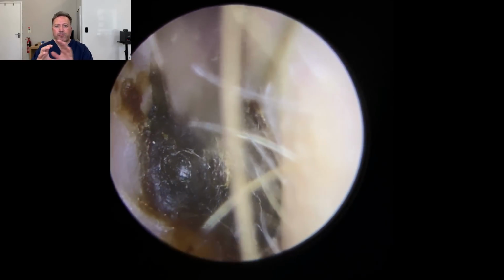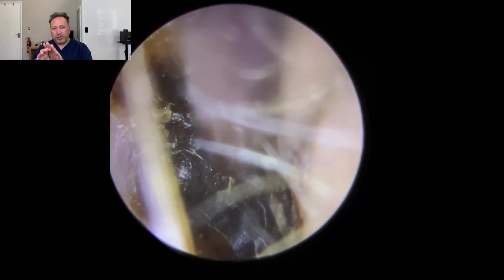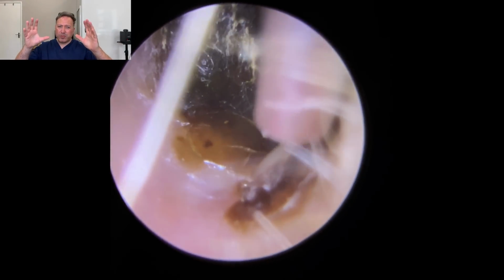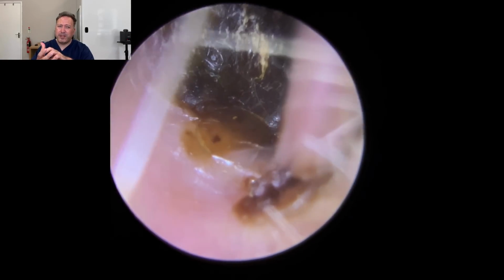Now what you can see has happened here is the wax at some point was probably quite soft. And then when they've pushed the Q-tip into the center of it, so if you imagine this is your wax, the Q-tip goes in and the wax does that around the Q-tip. So it spread it and stuck it to all the canal walls and caused this deep depression in the center, which is very, very deep in the ear canal.